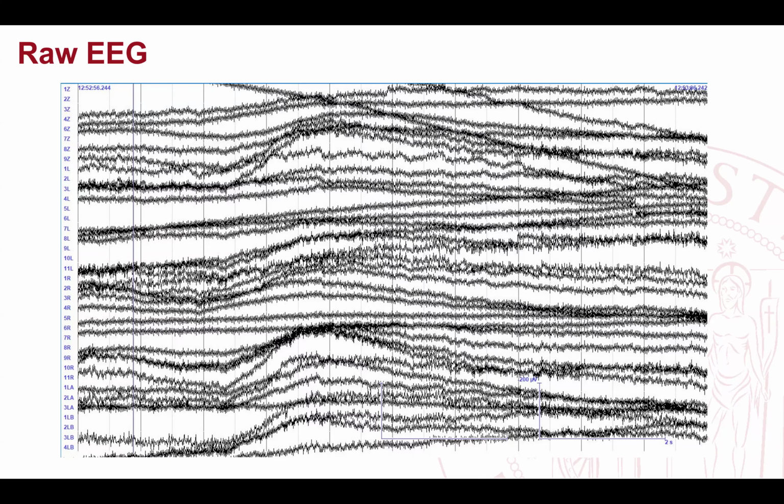You just record the signal, look at it and say, okay, here there's a movement, here there's not, here there's an activity, here there's no activity. In the EEG signal, this is not possible. There's no way you can extract information only by looking at the raw EEG. So we need a lot of processing to make this signal useful, and that's what we'll try to do in this lecture.